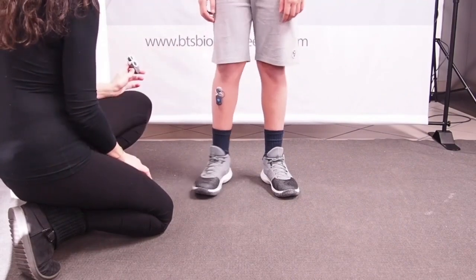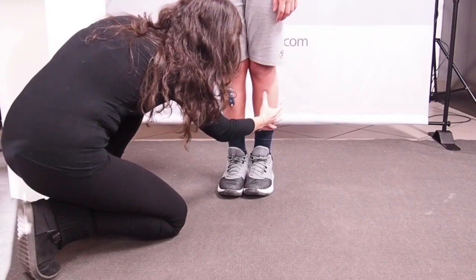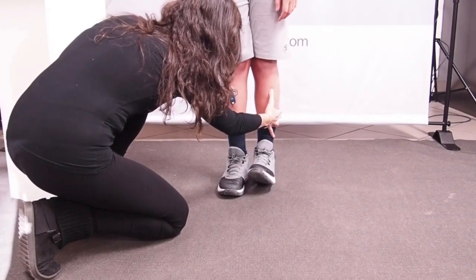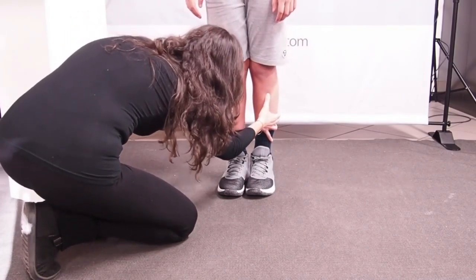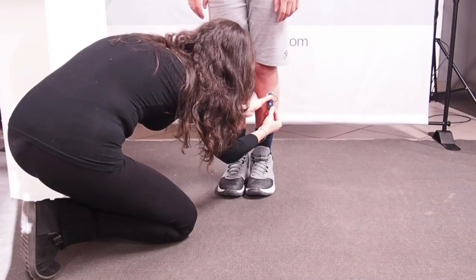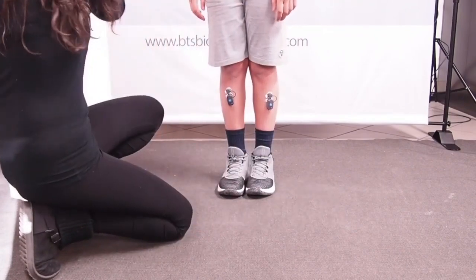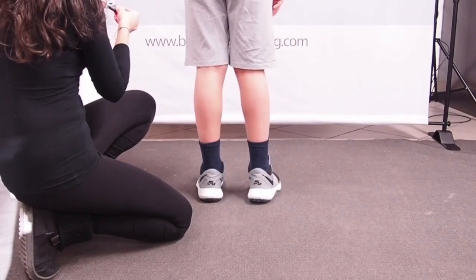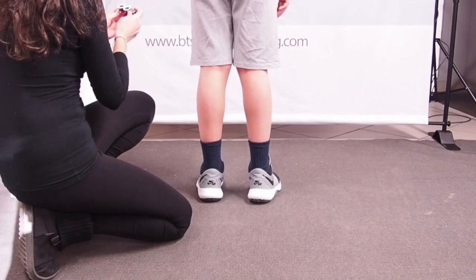I'd like to point out that palpation is always the best technique to identify the muscular belly. But there are different guidelines that help identify the point of application of the electrodes, starting from specific anatomical reference. In the case of the tibialis anterior, for example, we recommend to measure the distance between the head of the fibula and the lateral malleolus. Consider a proximal quarter and place the electrodes as shown frontally from the tibial crest.